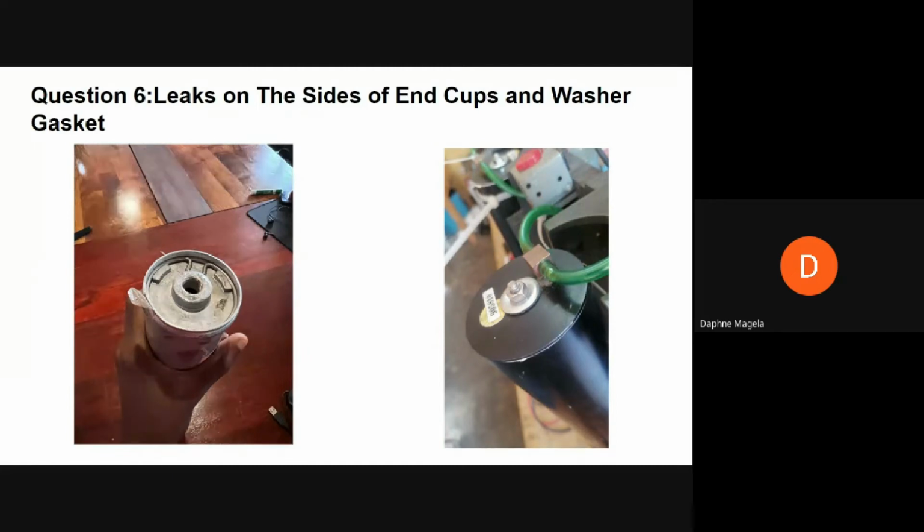So leakages in the sieve beds are one of the major factors that affect the oxygen purity of oxygen concentrators. Leakages allow ambient air to enter the sieve beds, contaminating the zeolite, hence reducing its absorption capabilities, leading to low oxygen purity. The process of refilling sieve beds is carried out in a room with the humidity below 45% in order to avoid contaminating the zeolite. And since the pressure test is done soon after refilling the sieve beds, it is always best to carry out the test in the same conditions, where the humidity is below 45%, for the same reason.